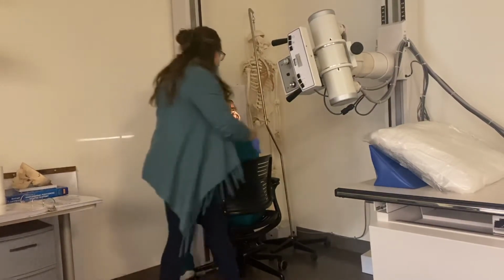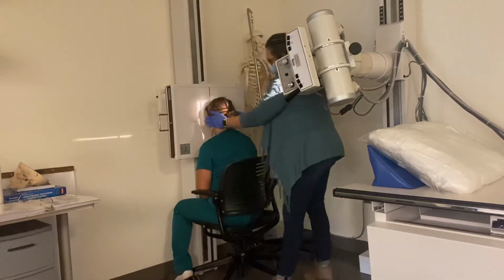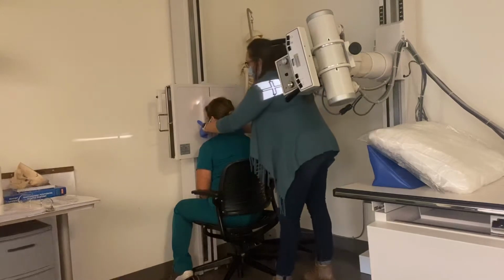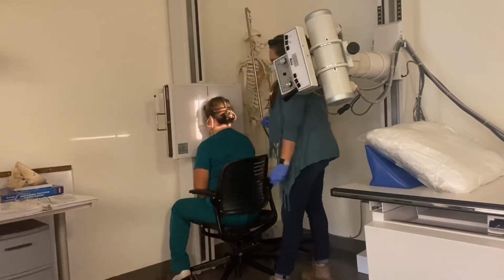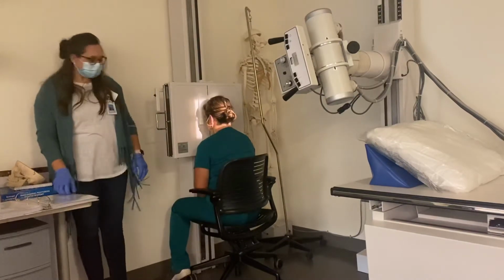So again, I'm gonna come behind her, make sure that that mid-sagittal plane is centered, and then that there's no rotation. And I would have her hold her breath, don't breathe, don't move.